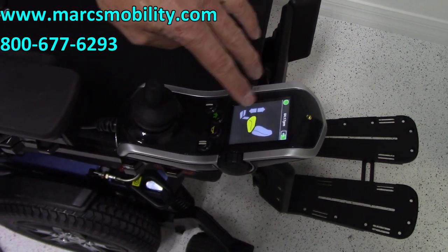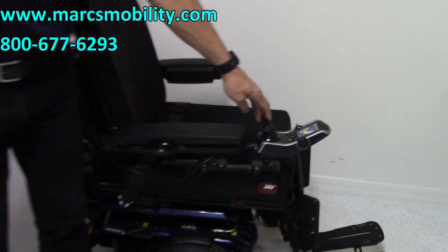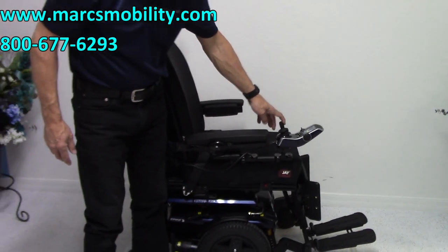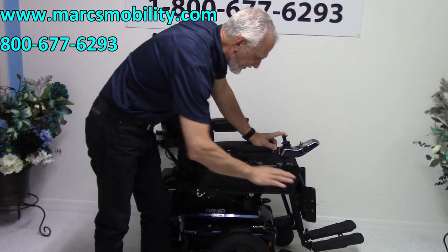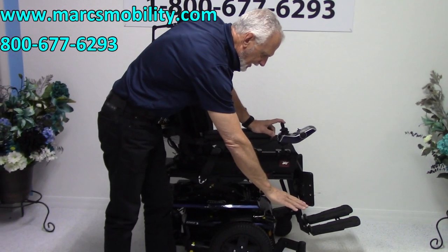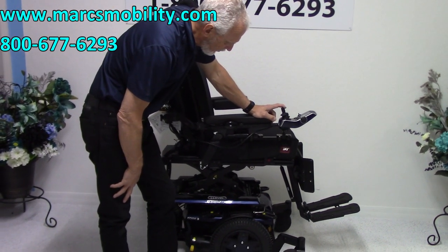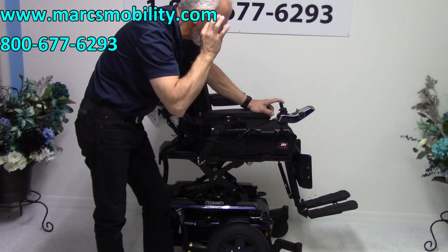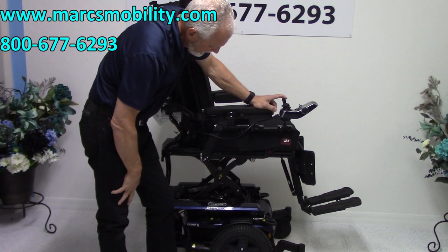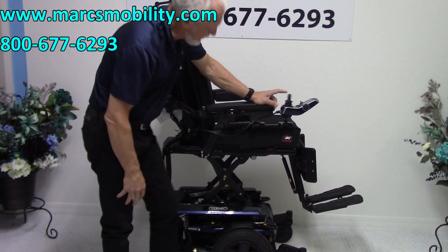Now we've only got the seat lift. Use your joystick right here to make the seat go up. This is 12 inches. You're going to start at about 22 inches, and by the time you're up, you'll be at 34 inches — 12 inches from the ground to the top, eye level. That's why they call it eye level. This is the 12-inch seat lift right there.